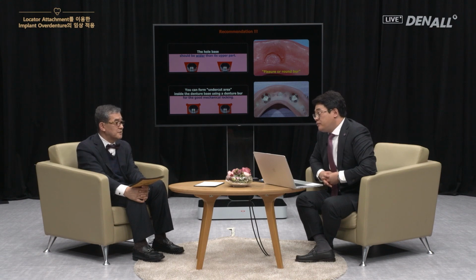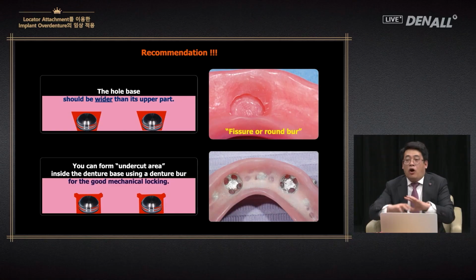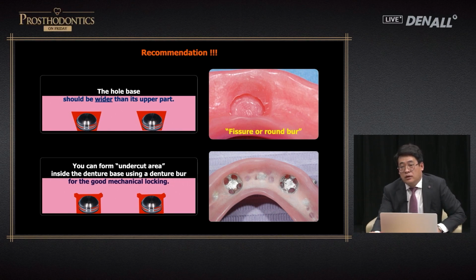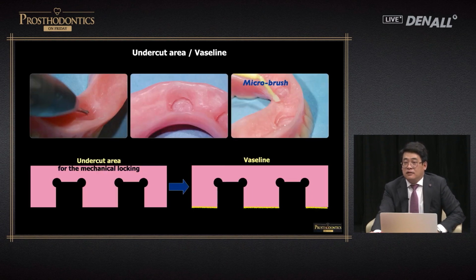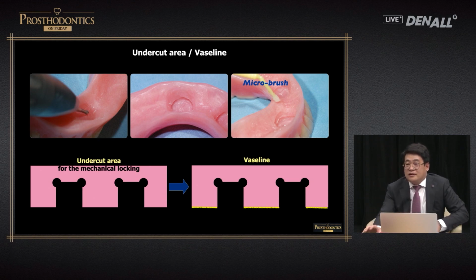As I mentioned earlier, when you design the metal framework, if the metal framework covers the processing cap, then you cannot get chemical binding, and it is very difficult to adjust the metal framework. Therefore, you should do it crisscross way and create undercut. And once attached, it doesn't fall out. And since then, I was able to avoid such problem.